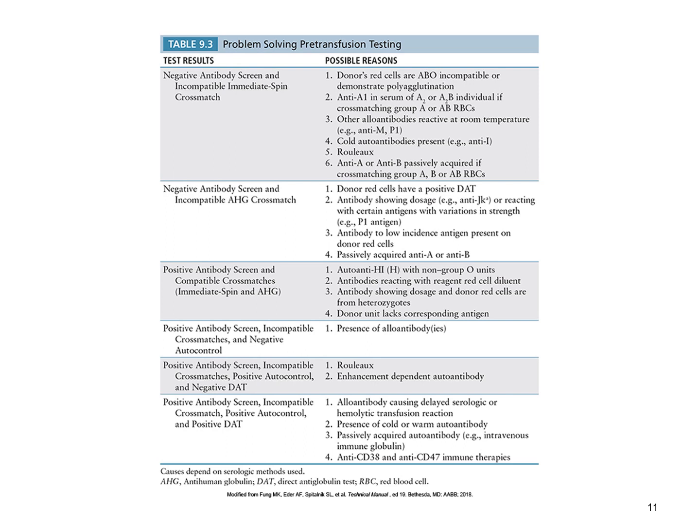And it even talks about a scenario, which let's hope you don't run into this, where you've actually got a positive antibody screen. You can't find compatible units. Everything's incompatible. Your auto control's positive. Your DAT's positive. Sounds like you've got a hot mess going on here.